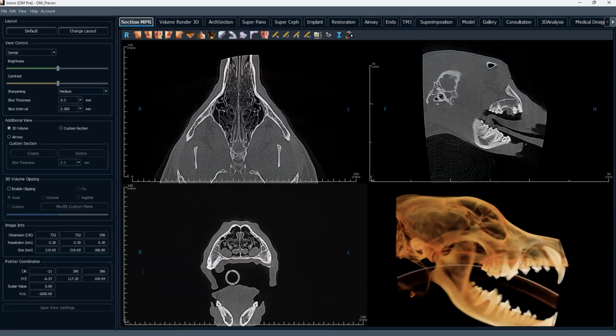And then I use those little paper curved rulers to follow the contour of the bone, and then either score the bone with a burr on a high speed or with a periosteal elevator, make a mark, and then come back with a piezotome and make that very precise cut to get exactly the piece of bone you want and uncap the ventral aspect of the infraorbital canal.